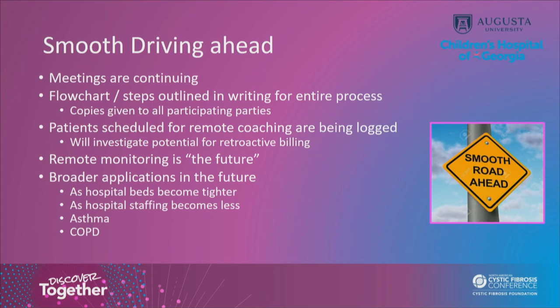So we have the order. Then once the spirometry session is scheduled, labels are printed with that encounter, because that was another issue: a lot of the reports were getting labeled with some of the leftover labels from earlier clinic visits. So they would populate in the medical record under a different date. So labels would be printed.